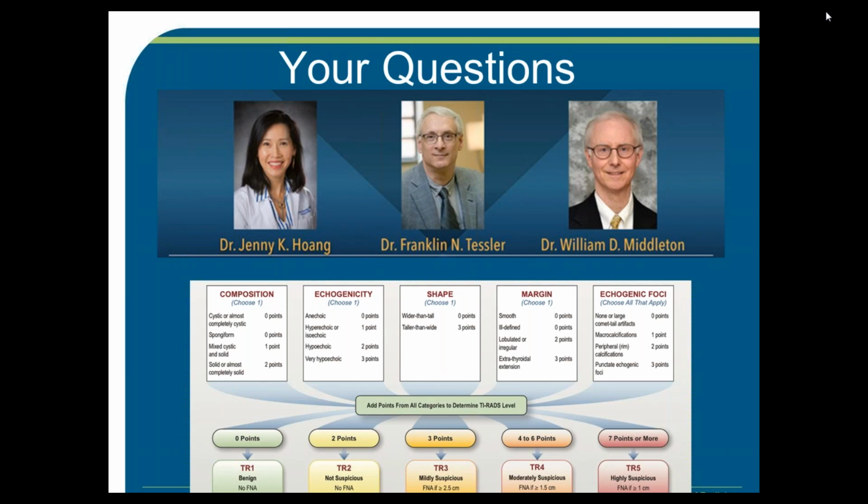Yes, certainly the educational component is really key, and I would recommend to the listeners that you forward the links to the webinars for your sonographers and your radiologists. It is a really very concise way to get up to speed with ACR TI-RADS.